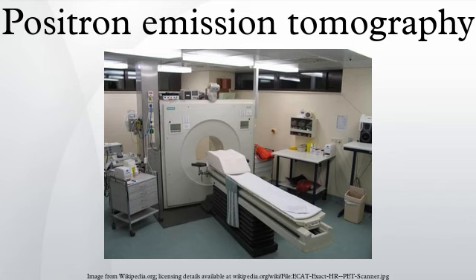In modern PET-CT scanners, three-dimensional imaging is often accomplished with the aid of a CT X-ray scan performed on the patient during the same session, in the same machine. If the biologically active molecule chosen for PET is fludeoxyglucose, an analogue of glucose, the concentrations of tracer imaged will indicate tissue metabolic activity by virtue of the regional glucose uptake.